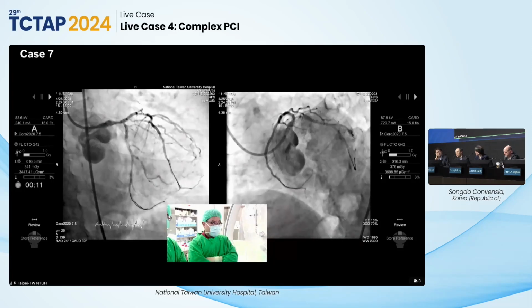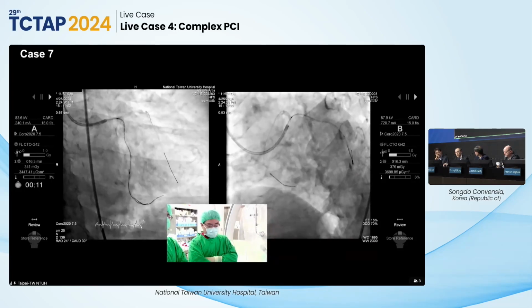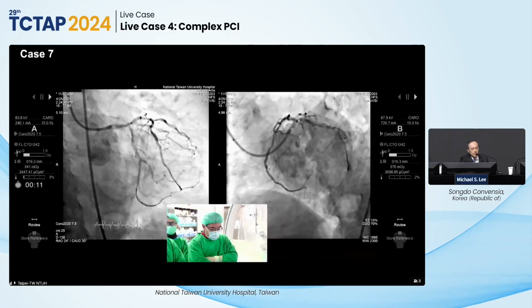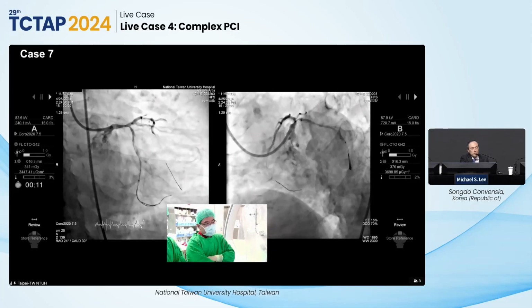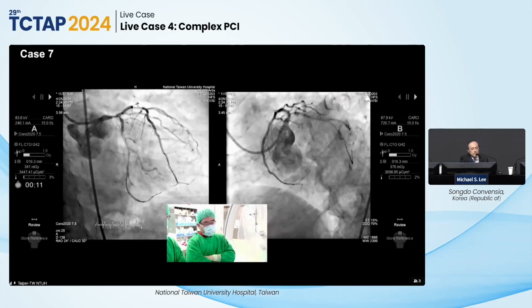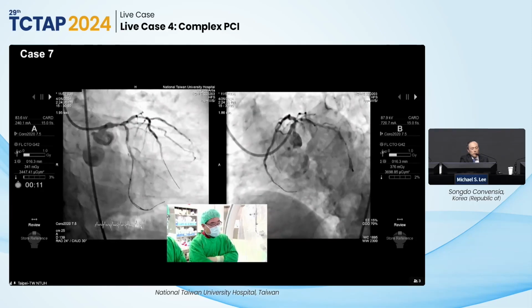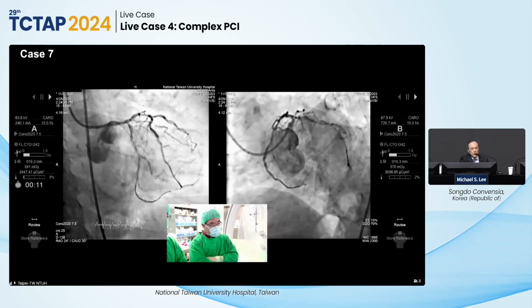Dr. Kao, hi, it's Michael Lee. Michael, yeah. What was your balloon size for the ostium of the circumflex? Was it a 2.5? No, it was just a 2.0, just for bringing down my OCT catheter. Got it. And also a good flow. What do you think about, well, first of all, what do you think the RVD is for the ostium of the circumflex?